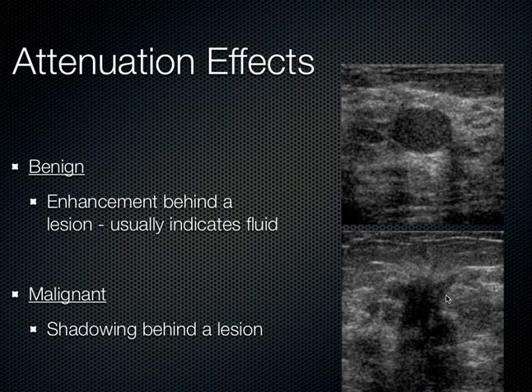And then another thing is the attenuation effects. With the benign mass, because they're not as dense, the sound can penetrate through them, and you actually get posterior acoustic enhancement. Think about the bladder or the gallbladder. Whenever you see those organs, behind them it looks more hyperechoic, more echo bright. That's similar to what's going on here with the benign mass. We see it's more hyperechoic behind the mass. Look at that compared to the malignant mass. It's all shadowing back here. So that's another major difference, the attenuation effects. The sound is attenuated much more in a malignancy, mostly because of its density.